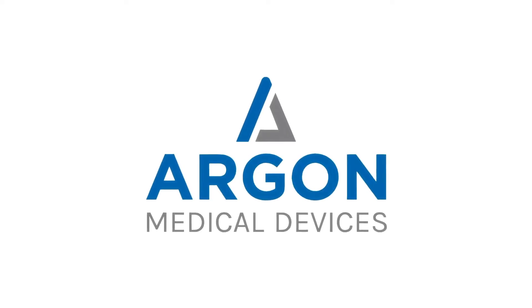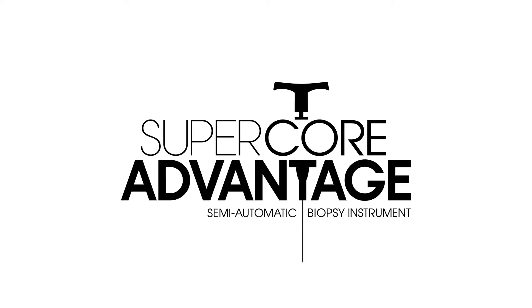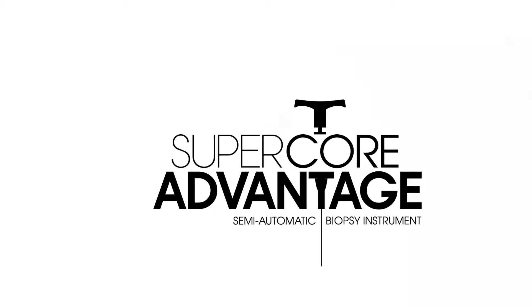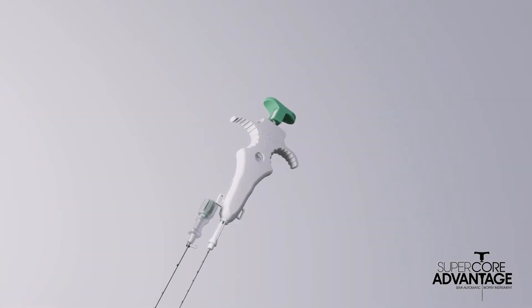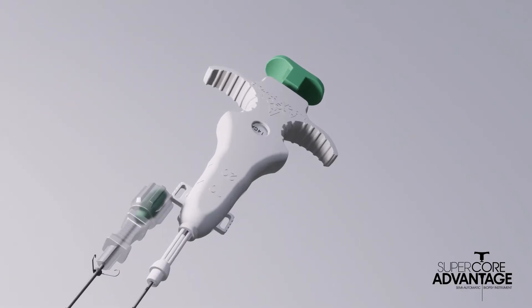Introducing SuperCore Advantage, the latest biopsy innovation from Argon Medical Devices. SuperCore Advantage represents the next generation of soft tissue biopsy technology, offering healthcare professionals a precise and reliable solution for their biopsy needs.